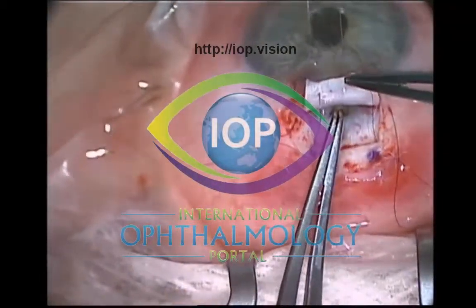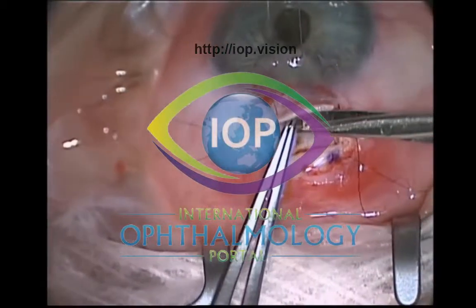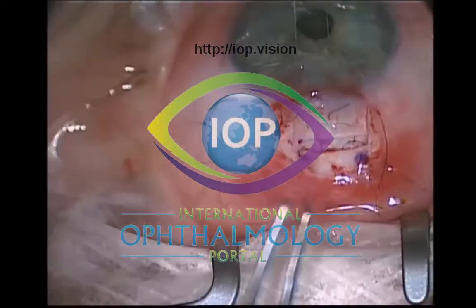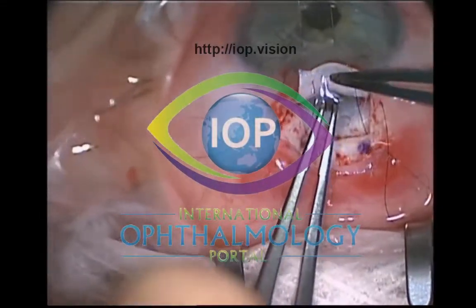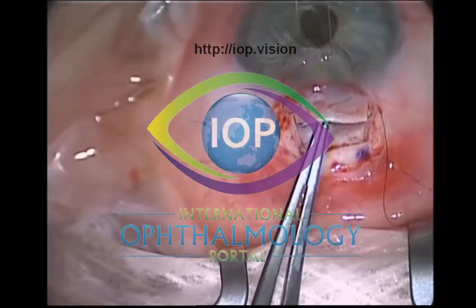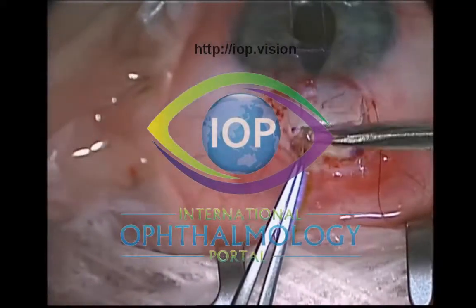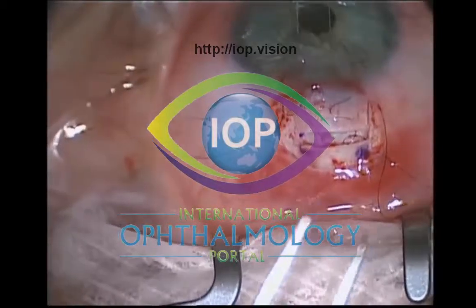It's quite an art to do the iridectomy and it can be quite an awkward step. You have your assistant infraducting the eye very gently — not pulling too hard, as often they get a bit excited and pull too hard. You've got your scleral flap potentially covering your forceps when grasping the iris, so I get my assistant to use a plain forcep to lift the scleral flap so I can see where my forceps are grasping the iris. I tend to use a toothed Colibri forcep, which has a nice angle to enter the sclerostomy and grasp that peripheral iris — not mid-peripheral iris.